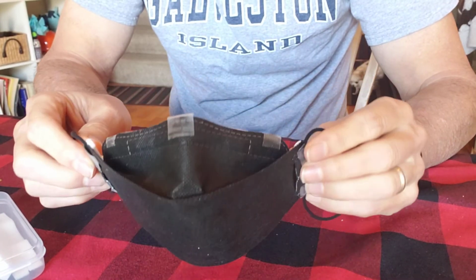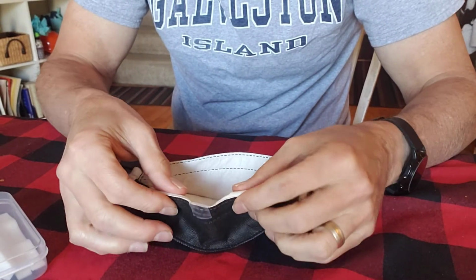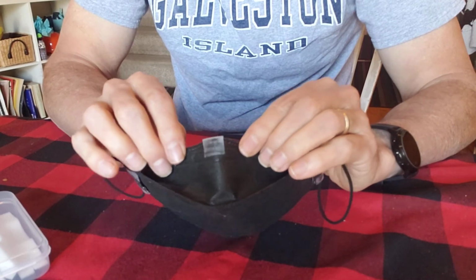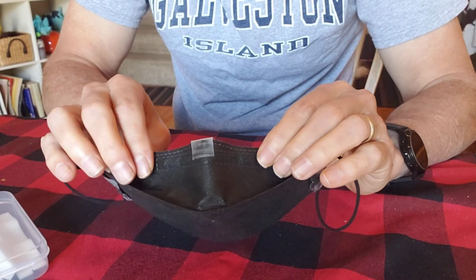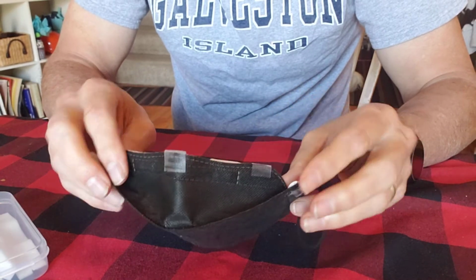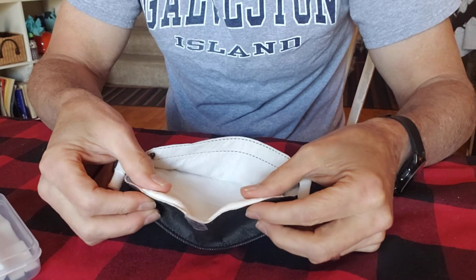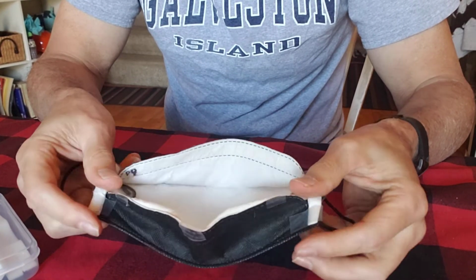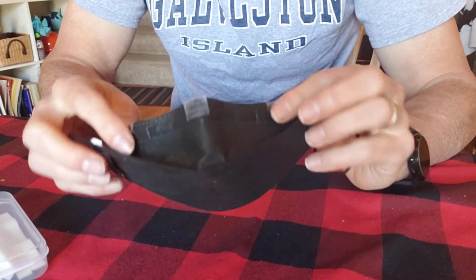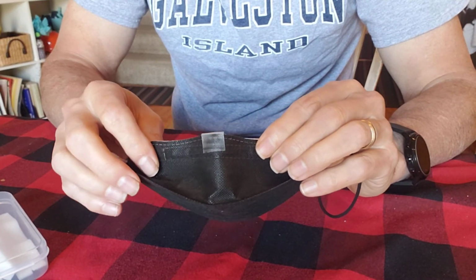But when you first put this toilet paper in, it may not actually work at first. What I found is I need to bend it 2 or 3 times and wait 3 or 4 minutes. It seems like it just takes a little bit of time and a little bit of bending before it seals well. I guess it just takes a little bit of time for the toilet paper to conform. And then if you've worn it and you put it down for a couple days and put it back again, and you do that quick check, it may be leaking again, and you just have to bend it again and let it sit for a couple minutes.